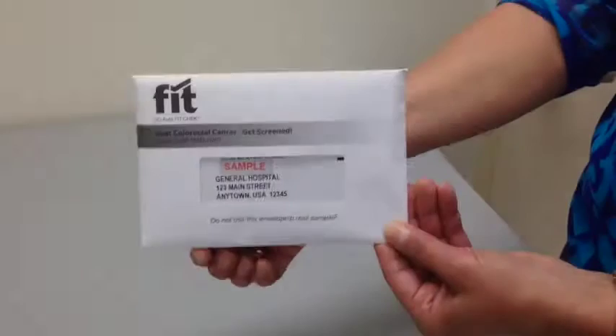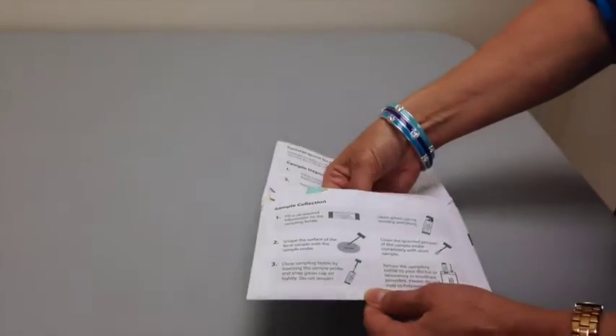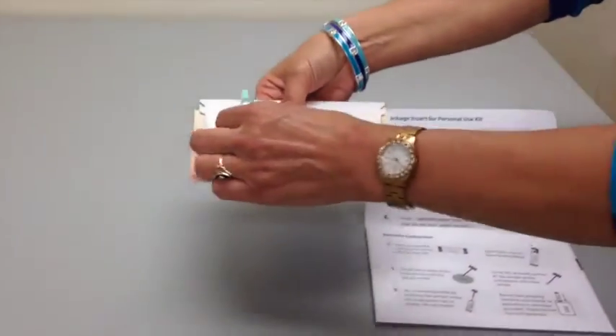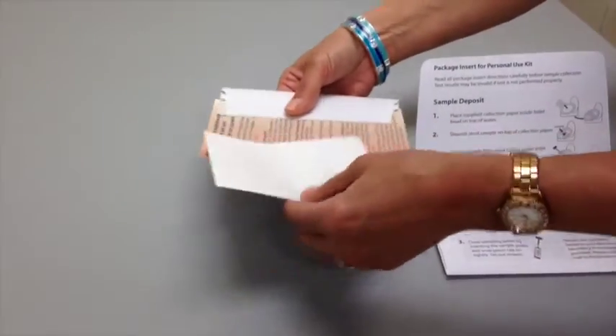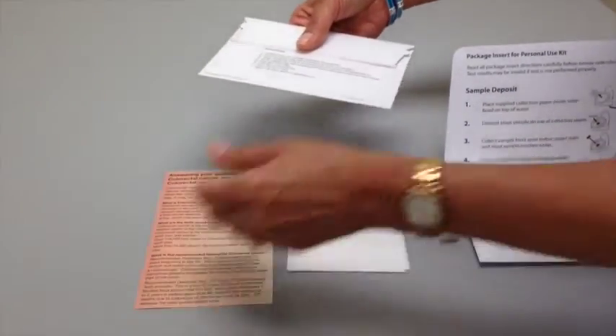OC Auto Sample Collection Procedure. The contents of the patient take-home pack include the outer envelope, sampling bottle, collection paper, and question and answer brochure.